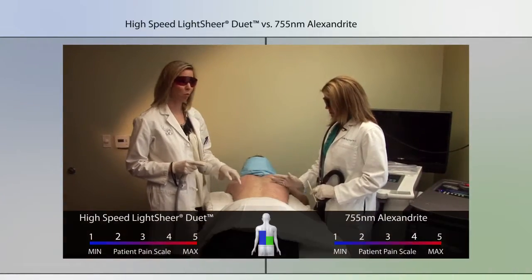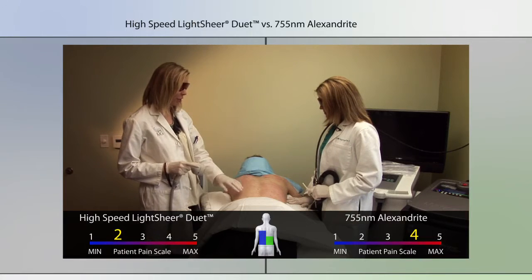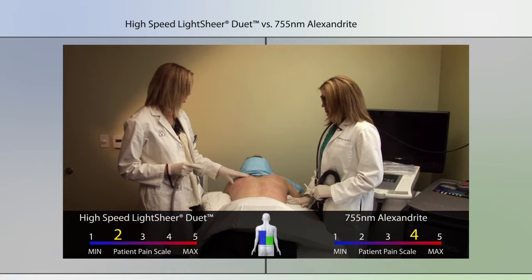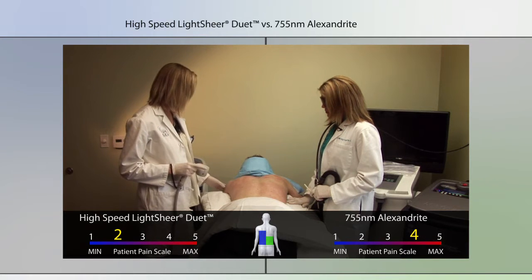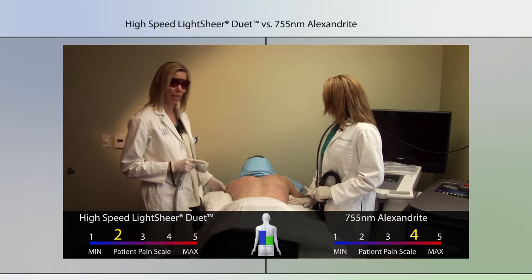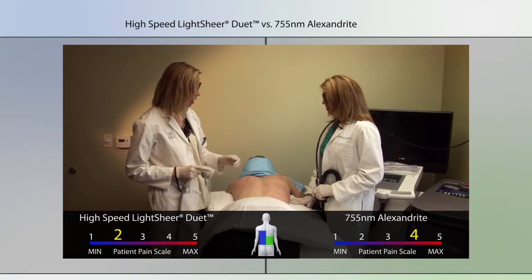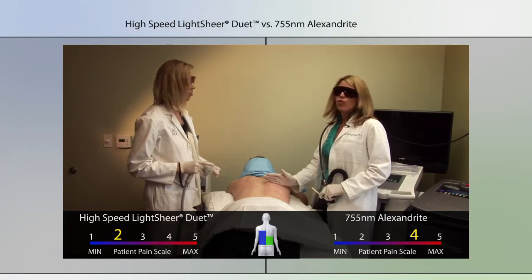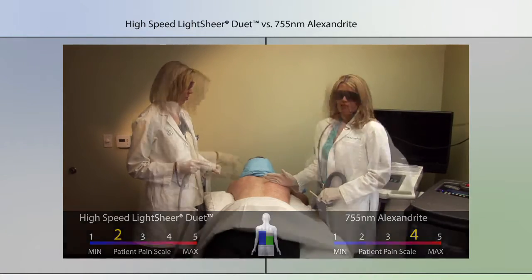So at this point, we'll take a second to stop. As you can see, I've treated the entirety of the left side of the upper back. We'll indicate again, I've asked the patient, on a discomfort level from 1 to 5, where he is, and he's indicating a 2 again. On the right side, where have you gotten to at this point? I'm right here at this point, and he's indicating a 4 on a scale from 1 to 5.